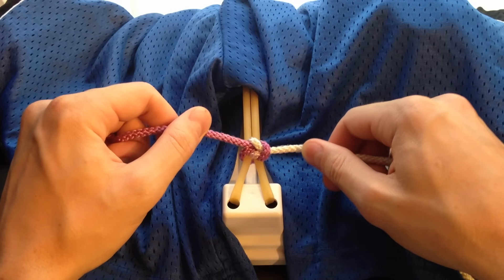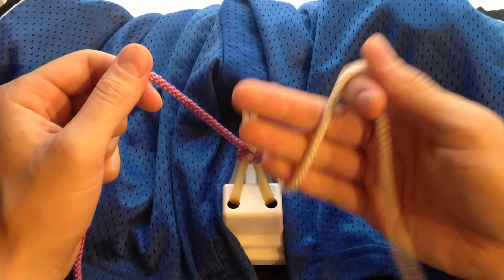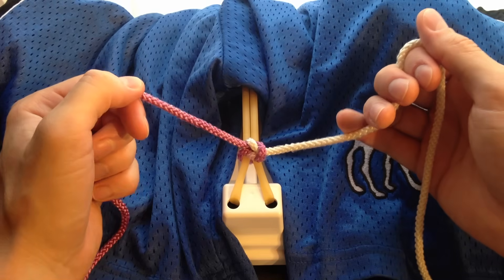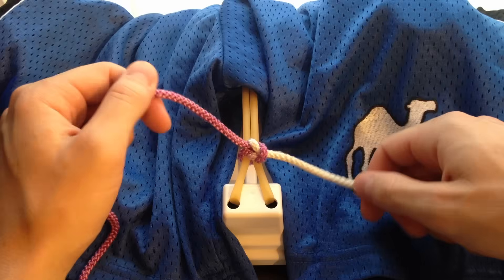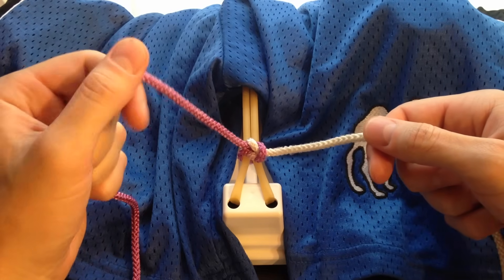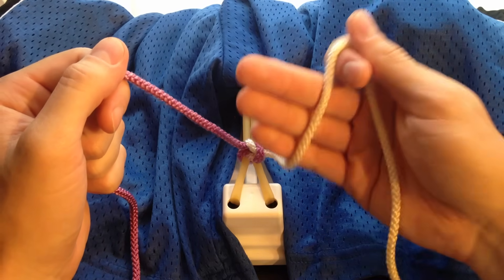So, to tie a square knot with the one-handed technique, first you do a karate chop, then you do a claw, and you get a square knot. Let's tie a second square knot. This time around, we're going to pay attention to which direction we're pulling the strings. So with our post secured, we're going to karate chop the string.